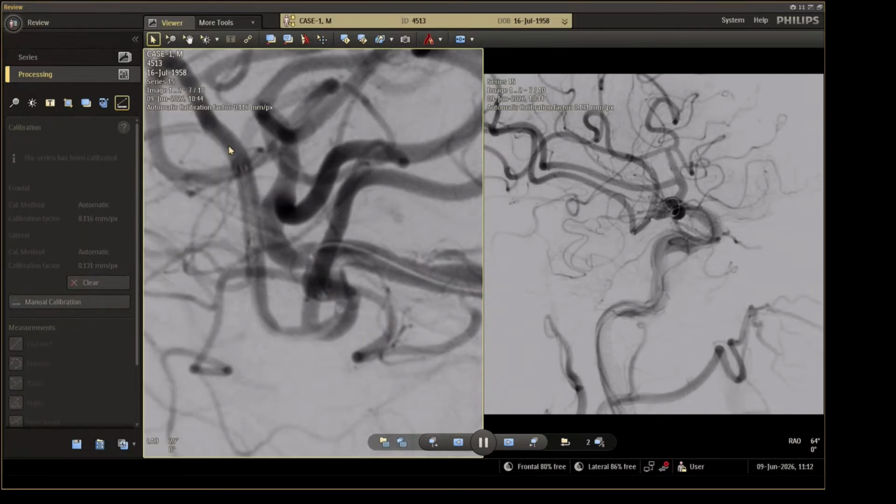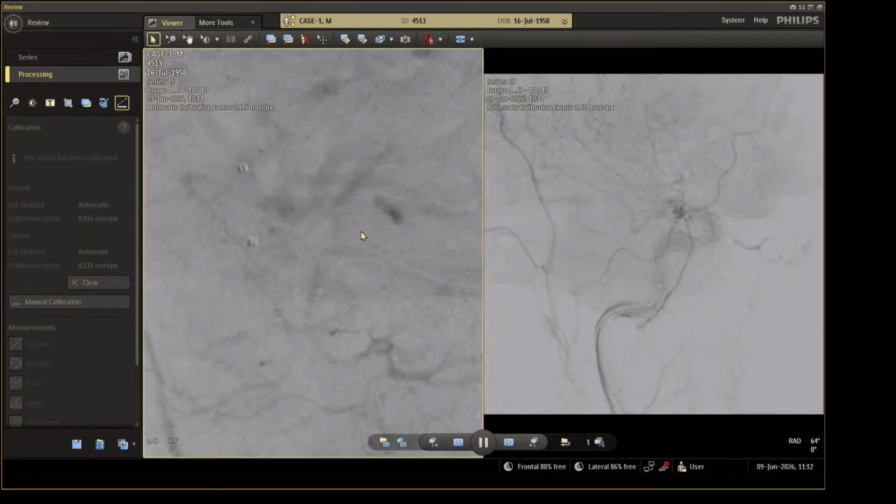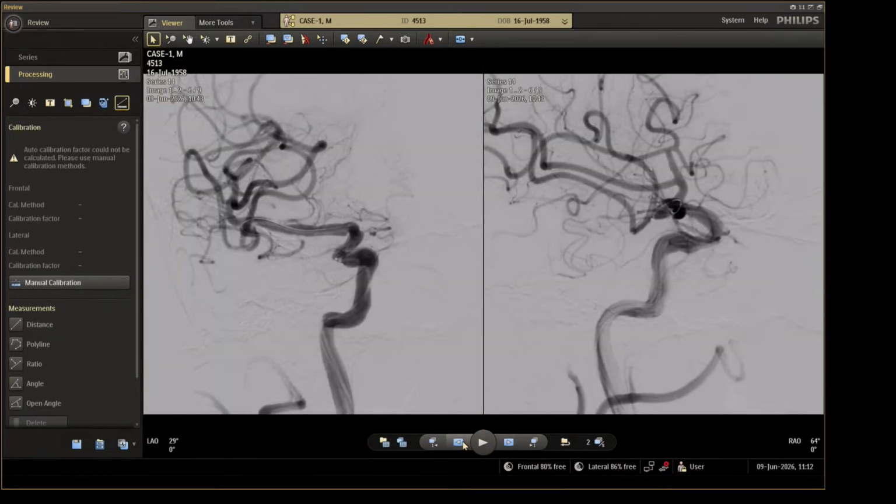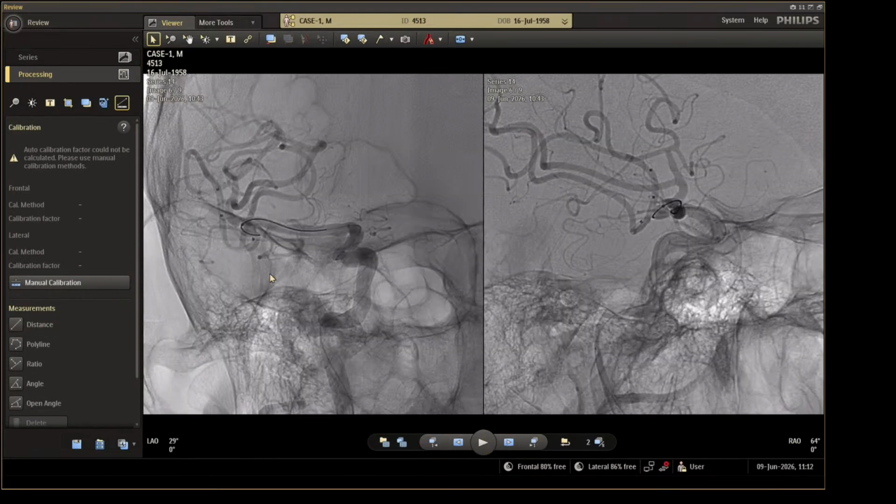As I said in the beginning to Jose Cohen, Jose, this is especially for you. We navigated the Chikai Black through this wide neck aneurysm and placed the Scepter in the lower branch. It was a Scepter C 4x15. 15 is my lovely length of the balloons.